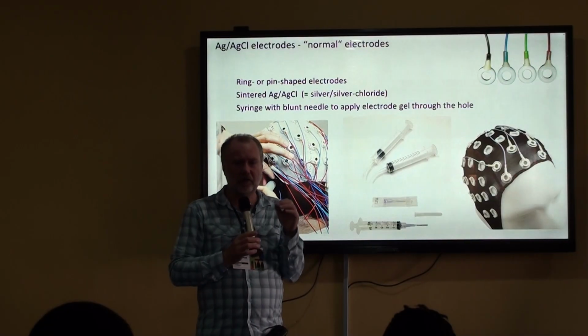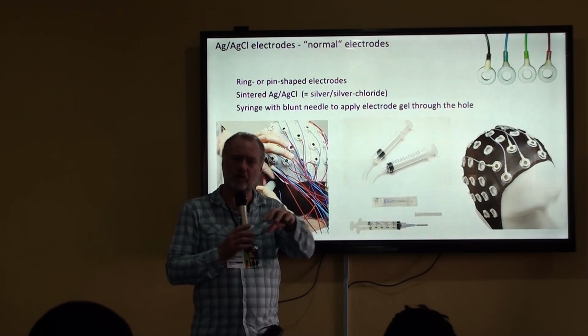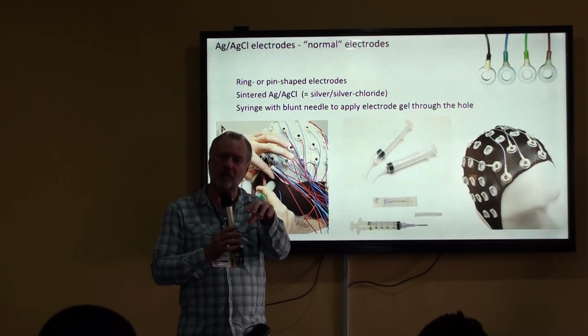But I do think that an important consideration there as well is that if the expert that needs to interpret the EEG is at a distance, then you also don't have the expertise to apply the cap.